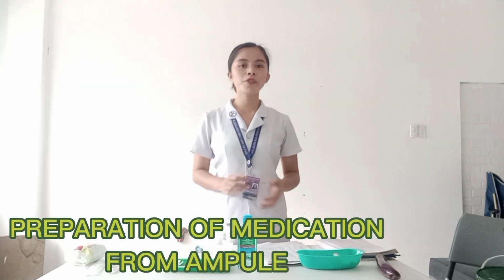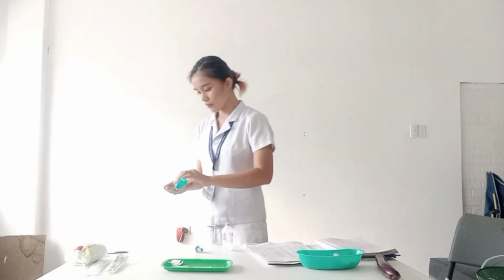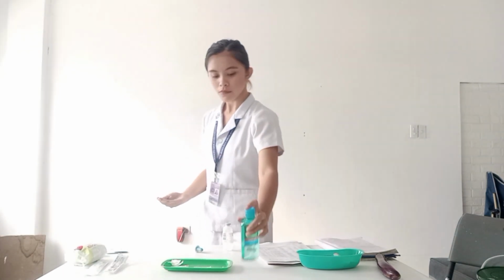I am now going to proceed with the preparation of the medication from an ampule. Of course, we have to perform hand hygiene to deter the spread of microorganisms. After that, let's proceed in preparing the medication for drug withdrawal. First is to flick the upper stem of the ampule several times with a fingernail. This will bring all the medication down to the main portion of the ampule.